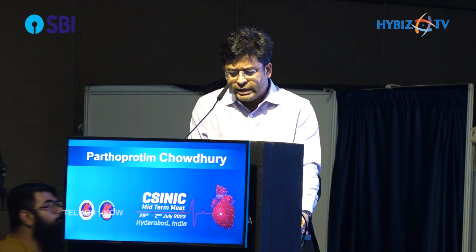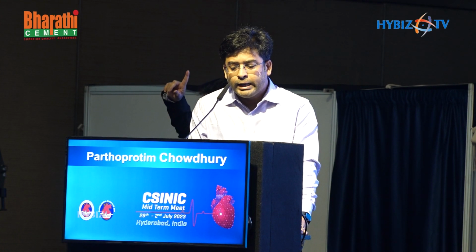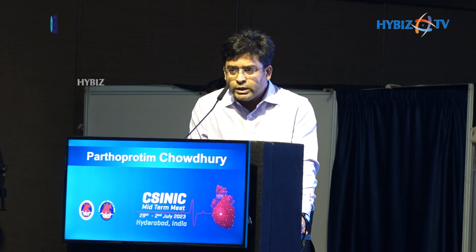Rest are when it is below or above, in the sinotubular junction. These are usually handled with AL2. Sometimes we require a specialty catheter while doing PTCA, like the right anomalous coronary artery opposite side launcher catheter. Then sometimes it is in the right sinus, but just at the junction of the right and left commissure. Usually they are also handled very well with an Amplatz. Sometimes when it is associated with tortuosity, we require special catheters like the Sherpa-NX balanced.